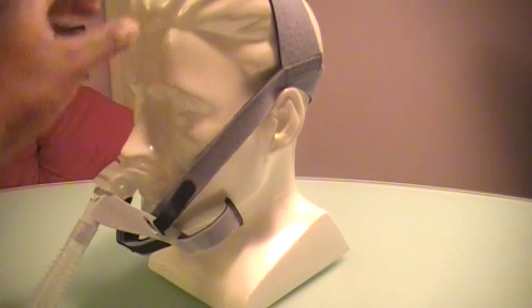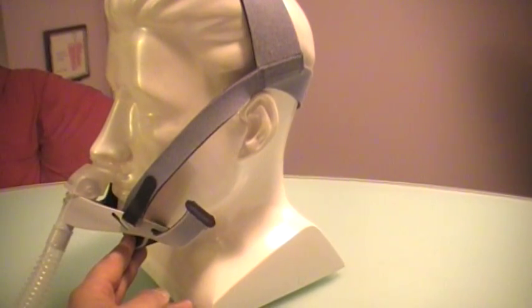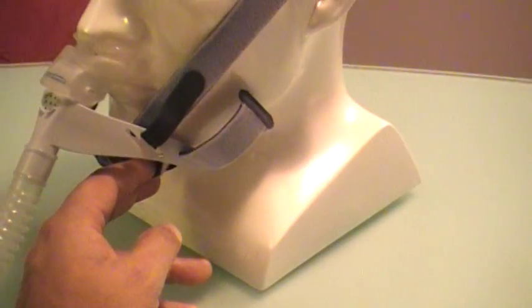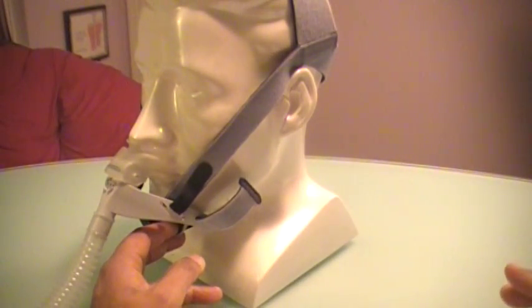This mask is fairly light. It has what appears to be a chin strap right here, but it is not really a chin strap to keep your mouth shut. It's actually there to stabilize the mask so it sits better on your face.